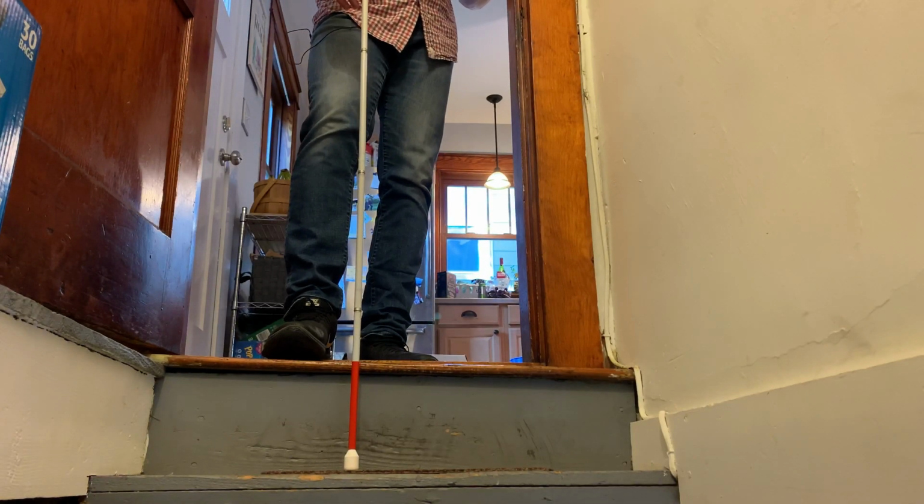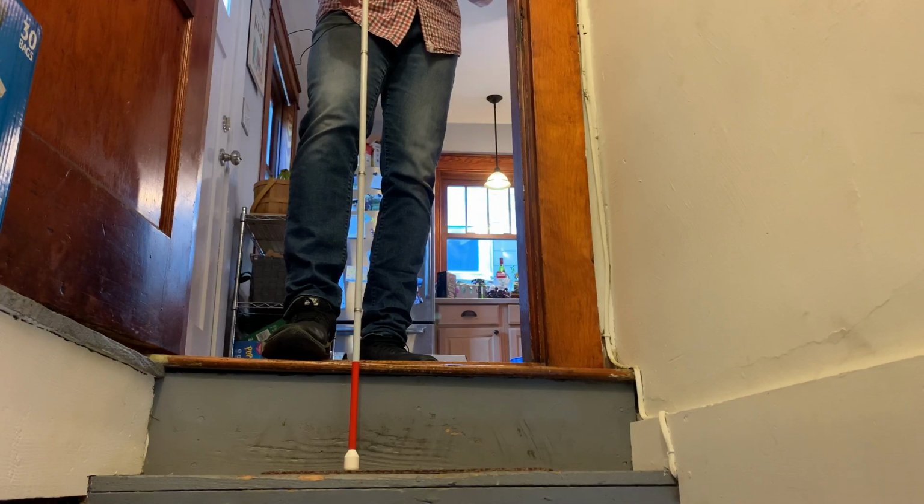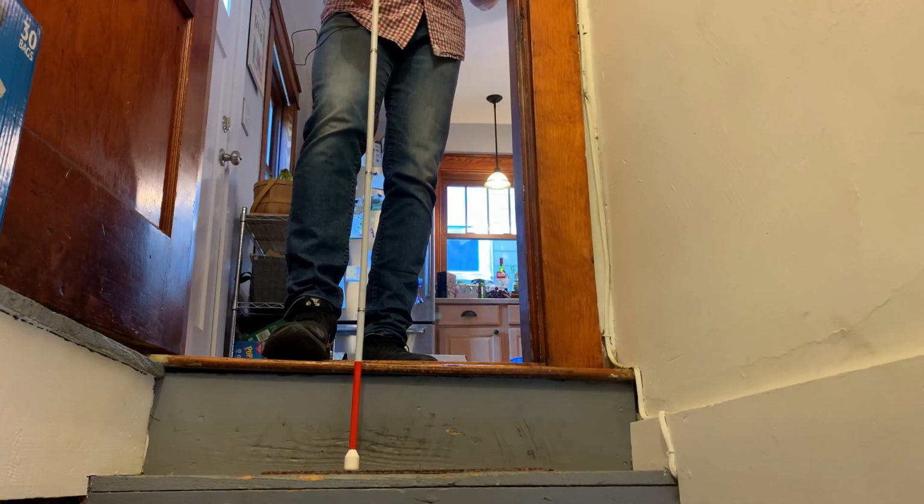And once you know how wide the first step is, you can kind of infer that the rest of the stairs will be a similar height and width, but that's not always the case, but for most stairs it is.